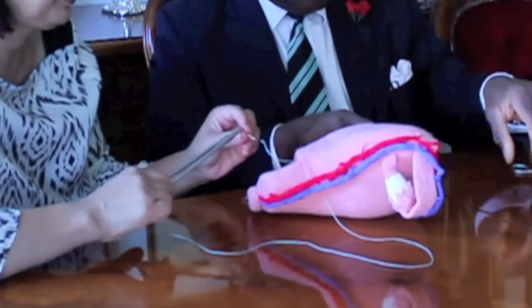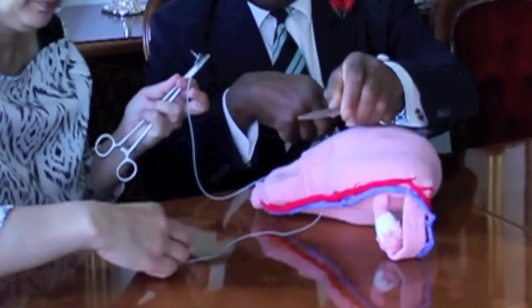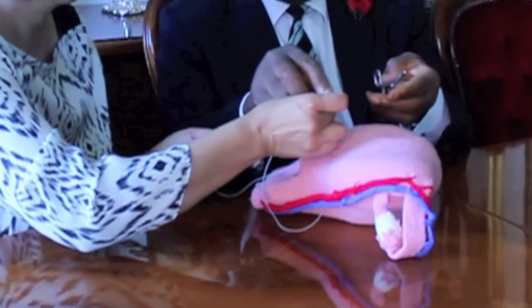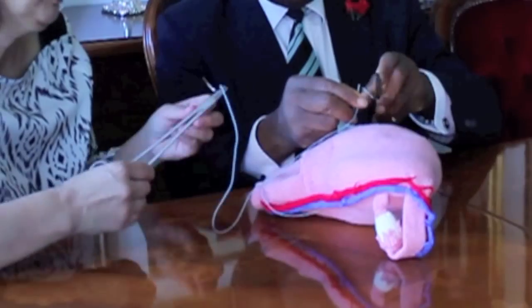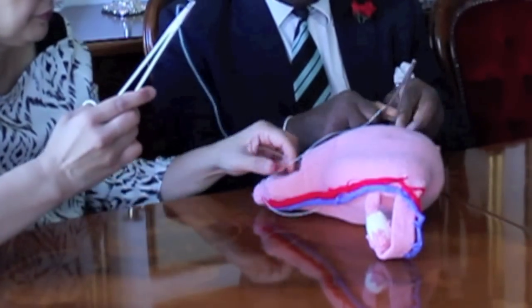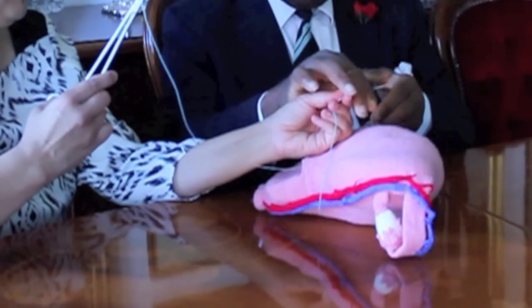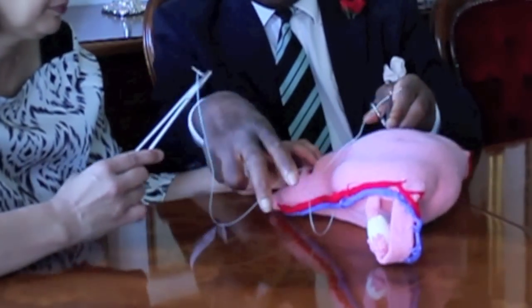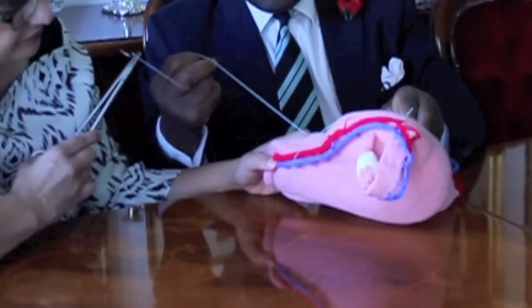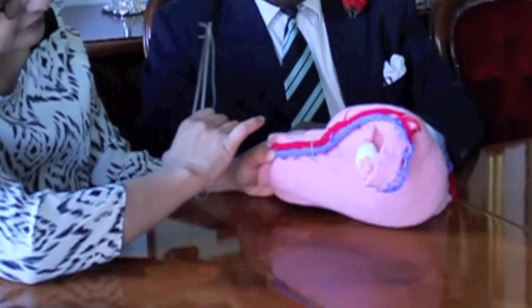The other limb of the suture is put on a clip so we do not lose the tension on it. Having done that, you give yourself enough length of suture to continue the procedure.